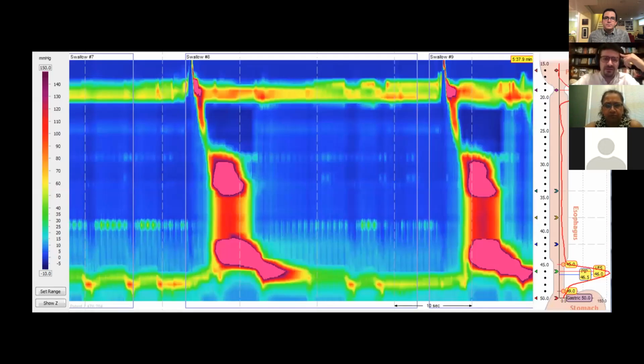Yeah, it is. I think you need a good clinical eye. You have a very good manometric eye. So that's why it's important to look at these with some regularity. If you are a foregut surgeon interpreting these, it does become apparent. Certainly, you can have this kind of mixed picture, and you're not sure if it's truly achalasia. But I don't know what to say. It is a gestalt thing. You look at it and you kind of intuit that, yeah, this isn't really achalasia per se.